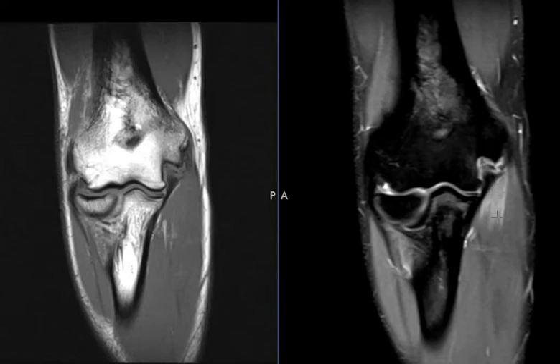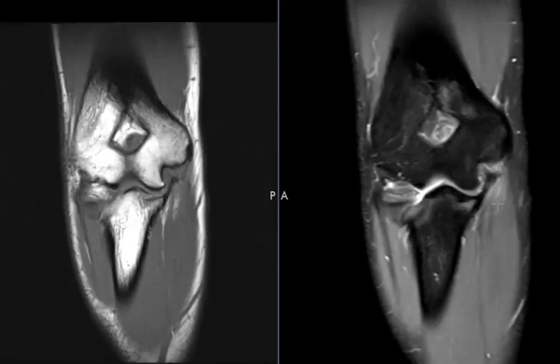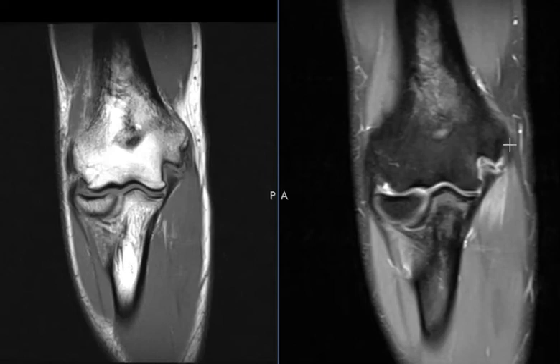You note also there's some brightness within the muscle here. This is the common flexor muscle — this is an associated partial tear strain of the deep muscle fibers here. There's something over the top of this, the common flexor tendon, and that looks like it's intact. Maybe some deep fibers may be partially torn, but really that is largely intact — it's just the ulnar collateral ligament attachment here.